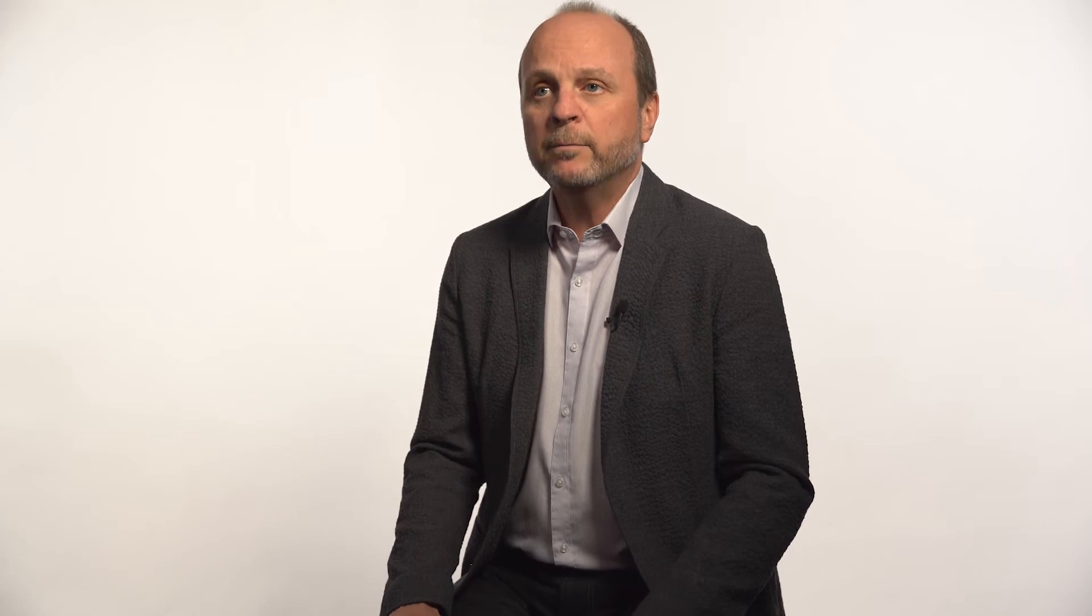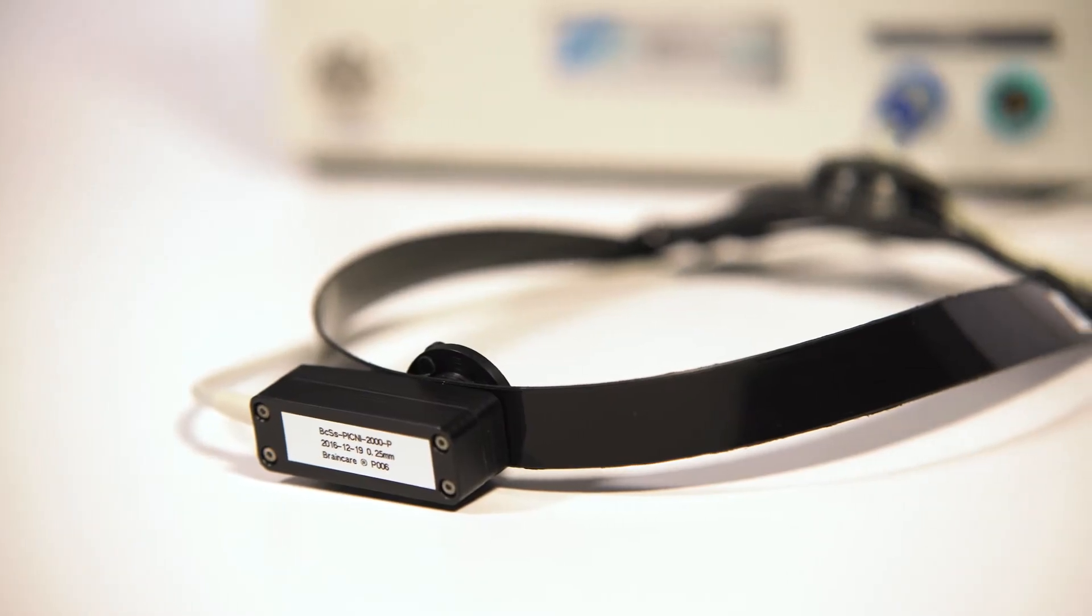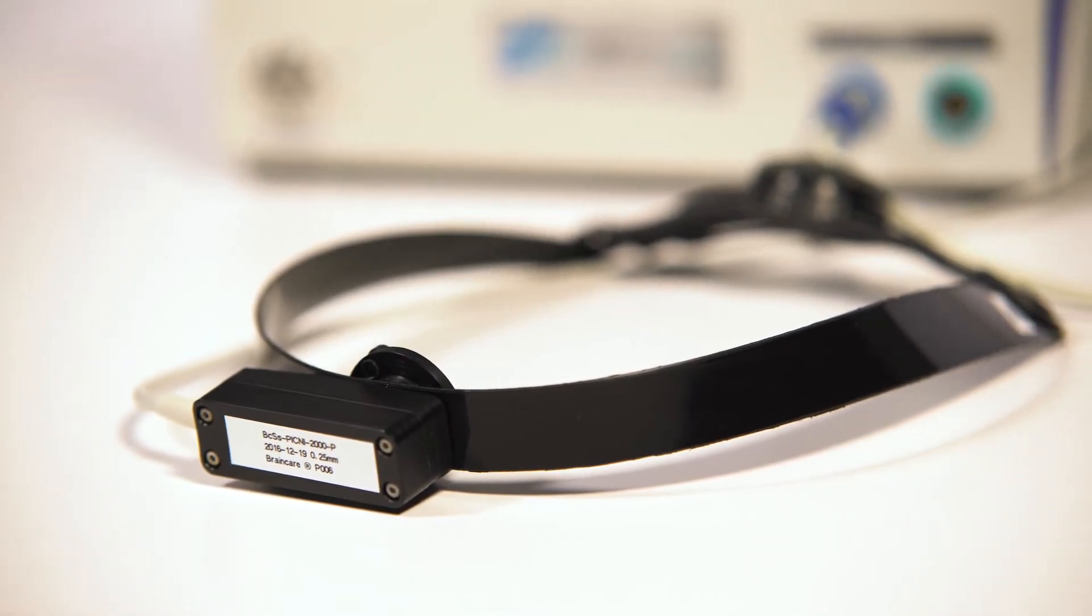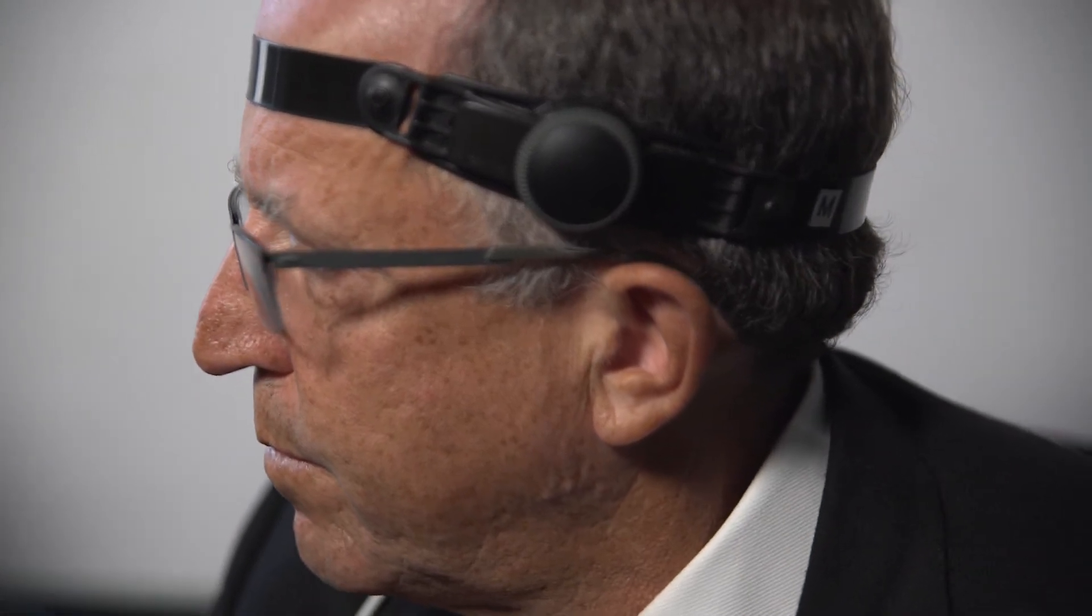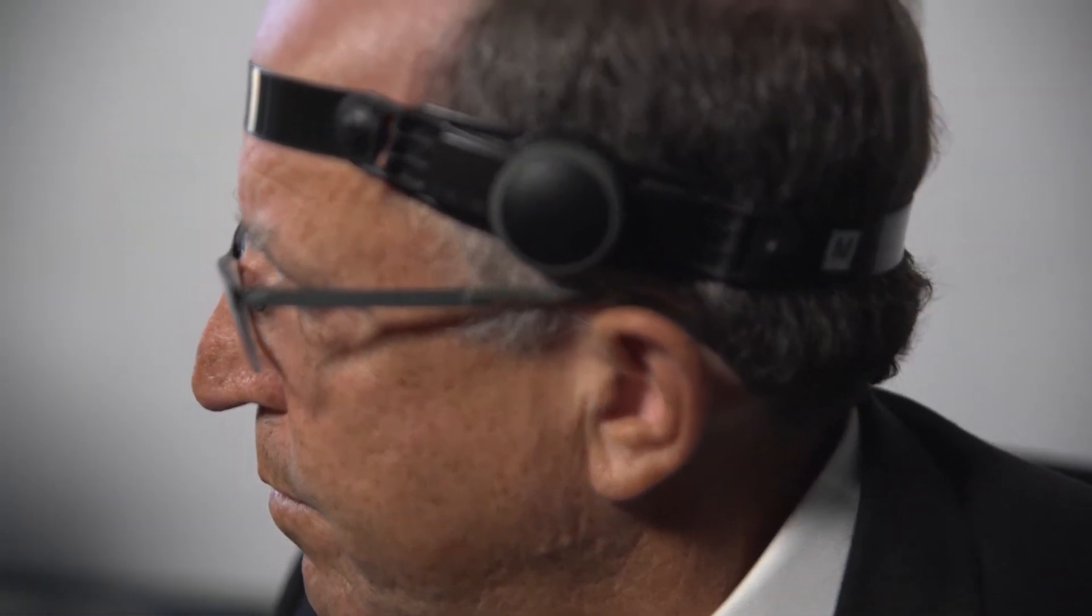BrainCare solution is a simple headband with a sensor that you just put on your head and you can monitor the intracranial pressure. As easy as taking your blood pressure or temperature.